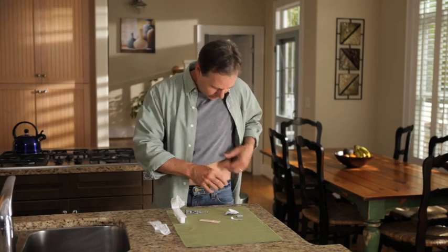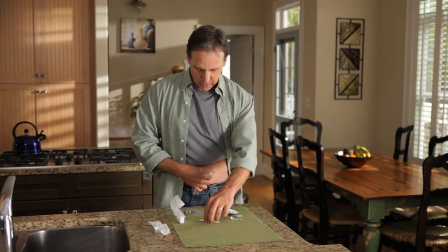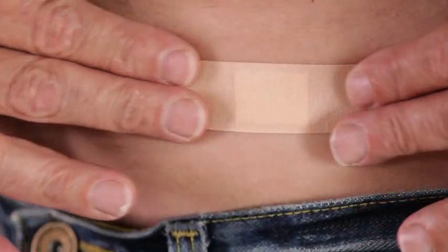Sometimes there may be a little bleeding at the injection site. So hold a cotton ball or gauze over the injection site, and do not rub the injection site. You can apply an adhesive bandage if you need it. That's it. The injection part is done.